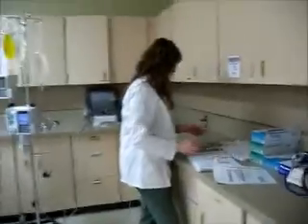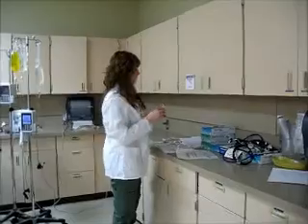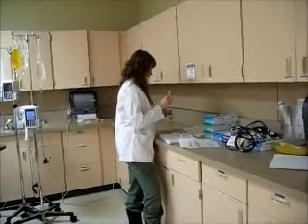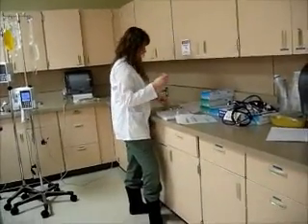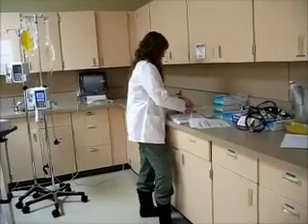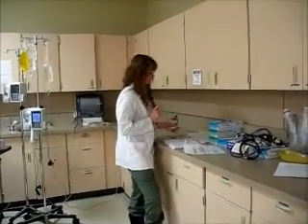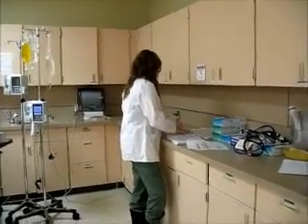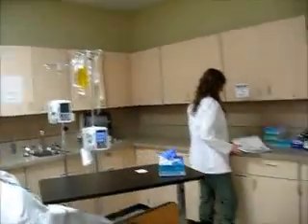Okay, so I'm going to take a flush. I'm going to squirt out 5 milliliters, and I'm going to put my insulin into it. Recap my needle. Okay, so here is my insulin. I made sure that cap was sterile. Alright, so now I'm going to go into my patient's room. Take everything with me here.